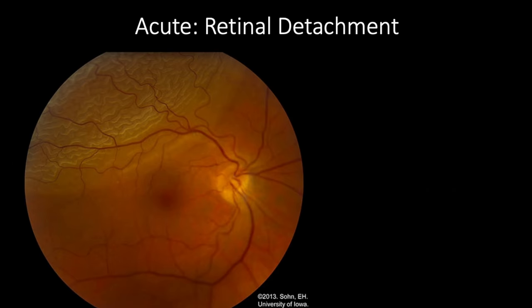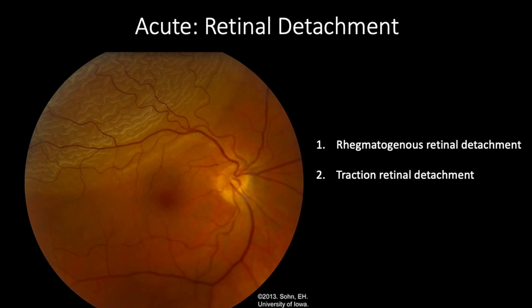The next acute pathology we're going to examine is a retinal detachment. Retinal detachments are sight-threatening conditions that occur when subretinal fluid accumulates between the neurosensory retina and the retinal pigment epithelium. There are typically three main ways this process occurs: a rhegmatogenous detachment, also known as a retinal tear, a tractional process, or an exudative process. The image on screen is a case of a rhegmatogenous retinal detachment; the detachment is lighter in color and crinkled upon itself like tissue paper.